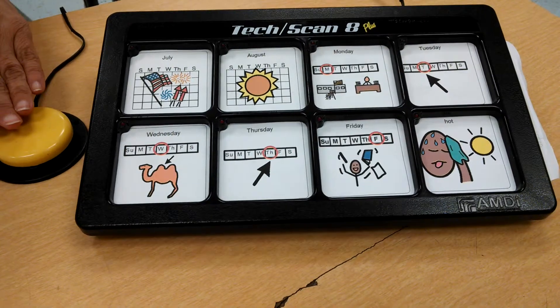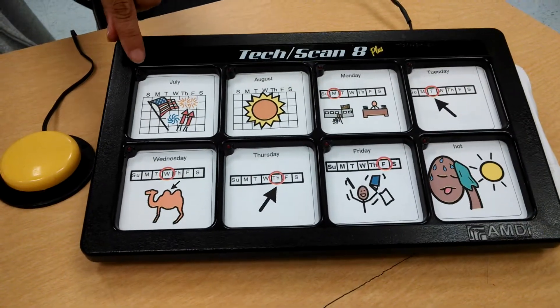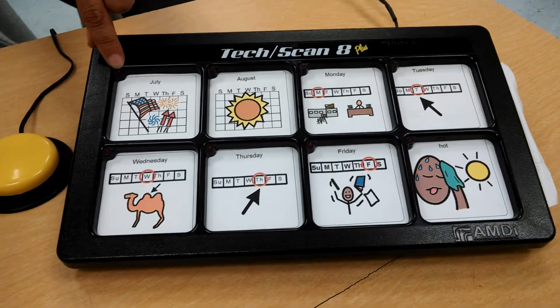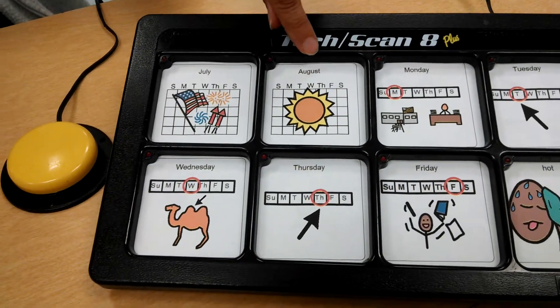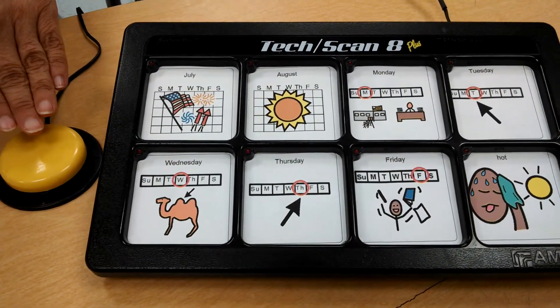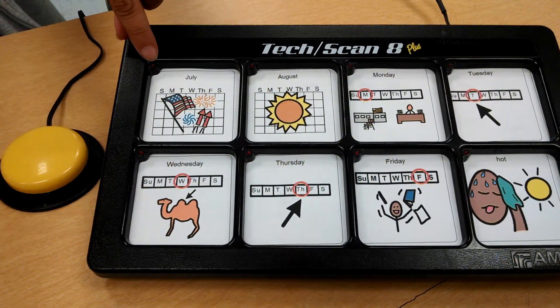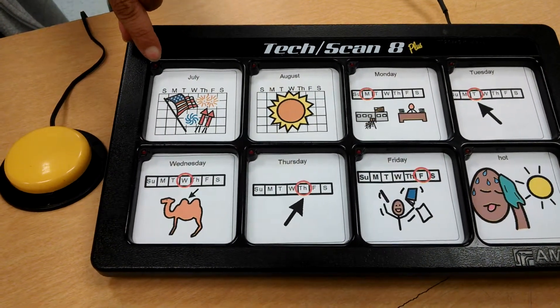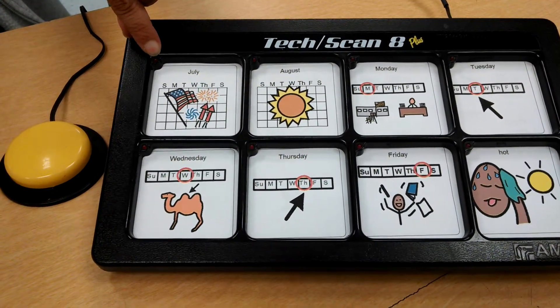when you hit this external switch here, it activates the lights up here. But what this one does is that it will not automatically scan from one message square to the next unless the communicator selects the switch. What it will do instead is when you select the switch, it will stay here. And if the communicator does not hit the switch again, it will then say your message.